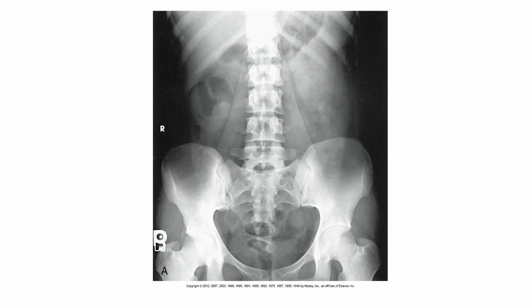As you get closer to the midline, it's kind of hard to see that lower border of the liver, but it is there. When we get to the PACS, if I find a good one, I'll zoom it up and you'll be able to see the lower margin of the liver really clearly. There in the middle of the top of the radiograph, that of course is the spine. That's the thoracic spine. And so that might be rib 12 rather than rib 11. I might have mislabeled that. Yeah, that's rib 12. So that's vertebral body 12.